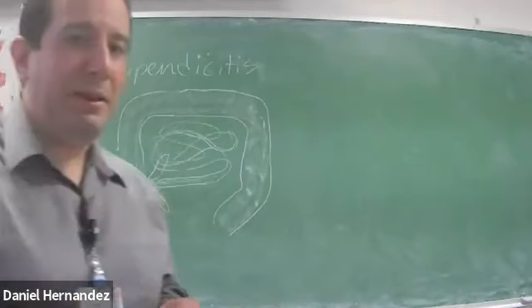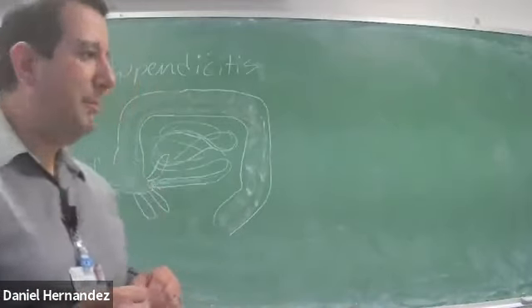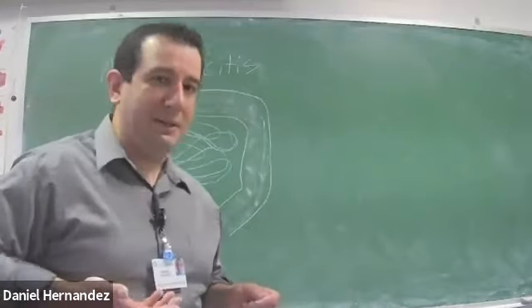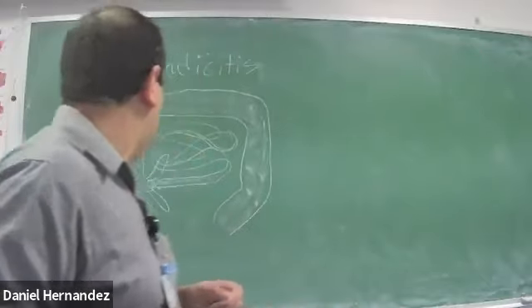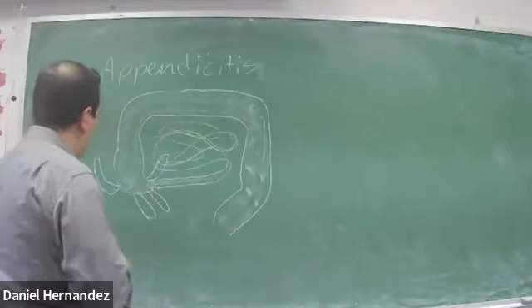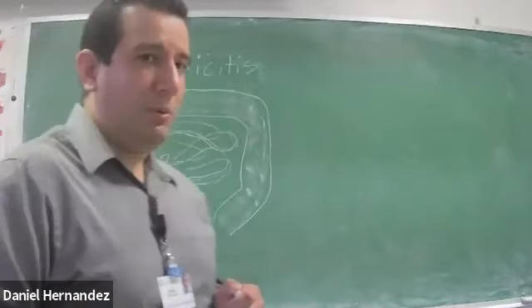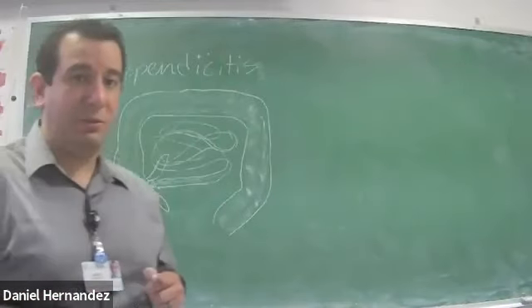So when you're doing these appendix ultrasounds, it's important for you to thoroughly scan around that base of the cecum and come up as high as even the liver. I've found a couple of appendixes practically touching the patient's liver. And conversely, I've seen appendixes run very deep. I found an appendix one time on a woman who was pregnant, and we were doing the transvaginal ultrasound, and I actually saw the tip of the appendix on the transvaginal ultrasound.